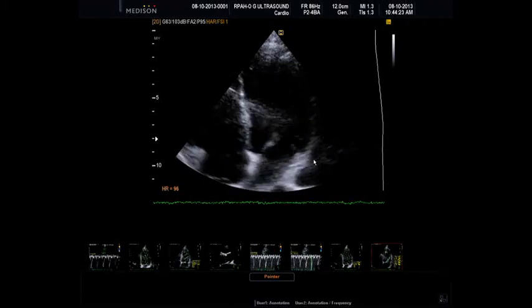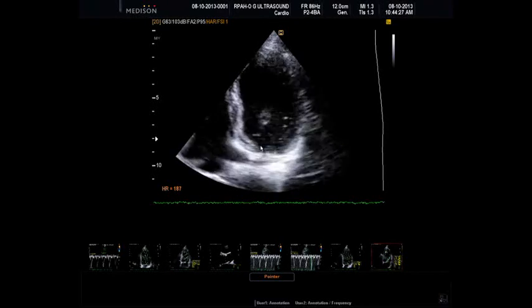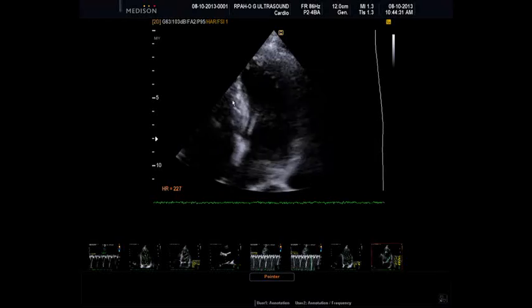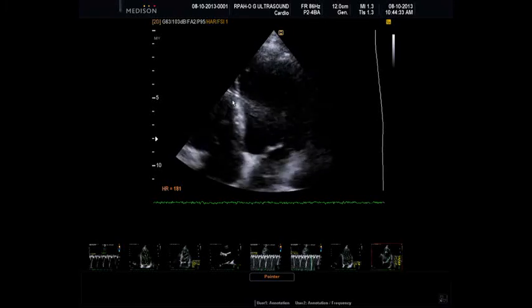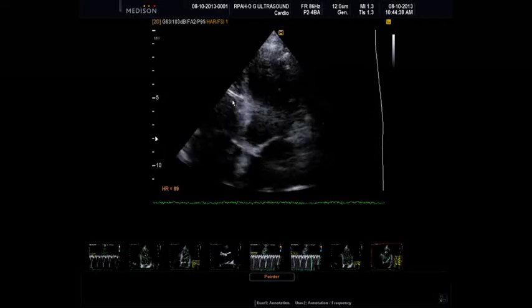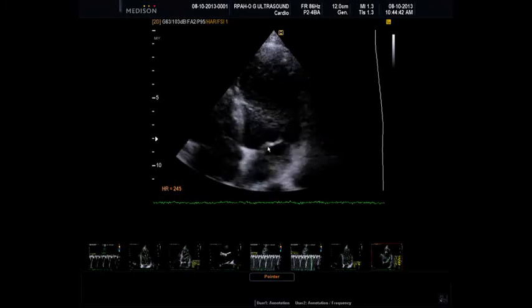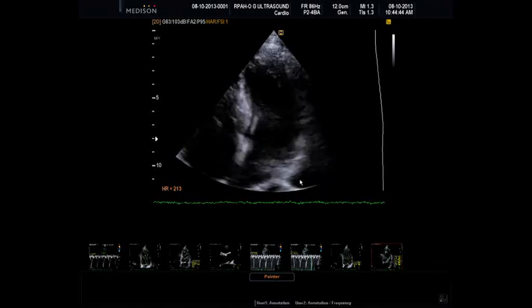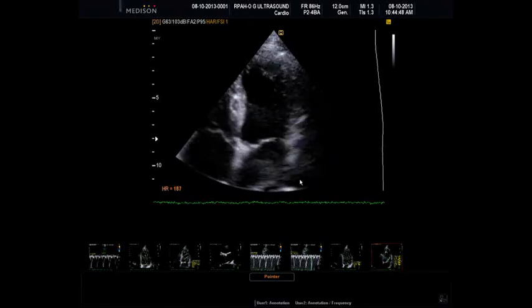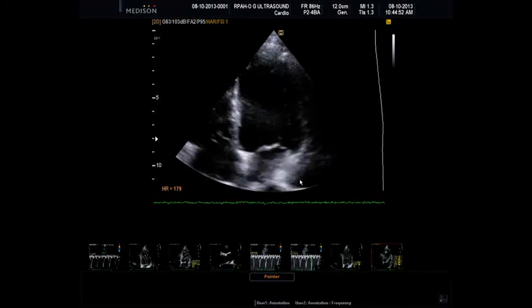So could you just explain to the less initiated what this artifact from left to right is? Is that the rib that you're trying to get across? Yeah, it's in the depth that you can't see. It's in the third dimension, so it's hanging off the rib, and you get that displayed across. You just have to think of it and look past it. That's right. I'm sort of angling right off the edge, so it's just ribs and lungs you've got to get around.